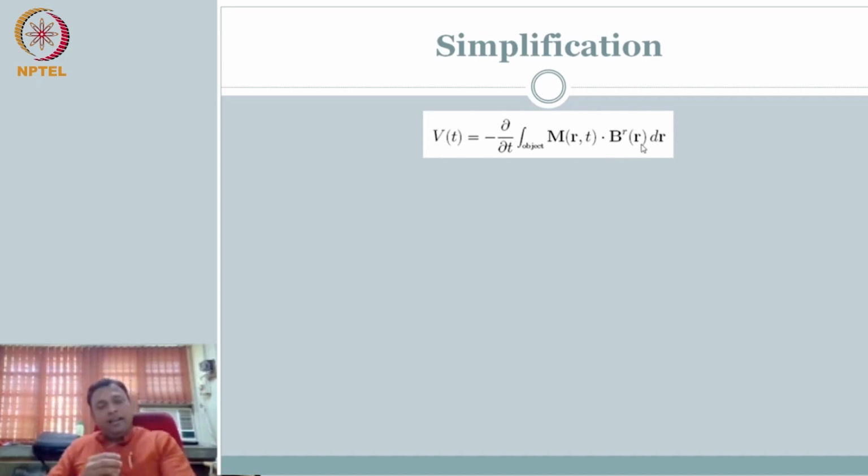Why should it be? Let's assume that I have a coil which is equally sensitive to all r, that is, if I apply a current, it creates a magnetic field at location r. That is how we got this BR using the reciprocity. So we will say that whatever magnetic field, wherever it is created, it will proportionately create the corresponding voltage.